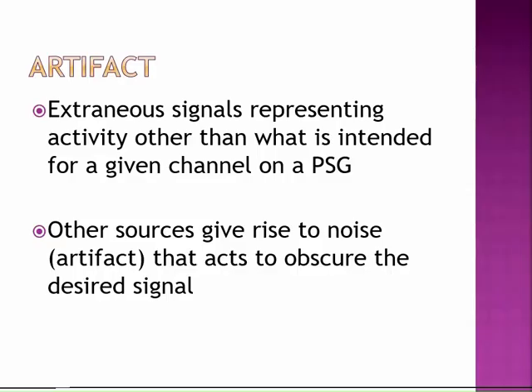So anything that can cause noise or artifact within the channel can really obscure and make it difficult to read what we need to read. Because you've got to think that we are trying to read these very minute electrical potentials in comparison to all the other electrical activity going on in the room around the patient and the electrical field just coming from the outlet. So there's a lot of instrumentation and extras going on to really make sure that we're seeing a decent channel.